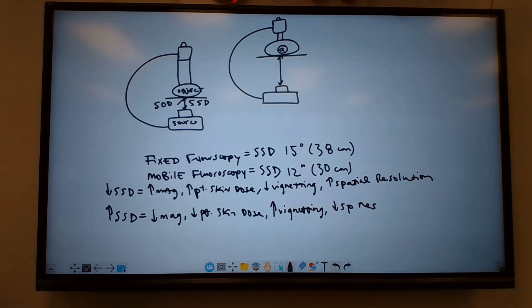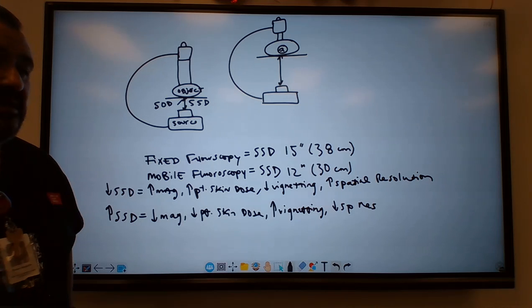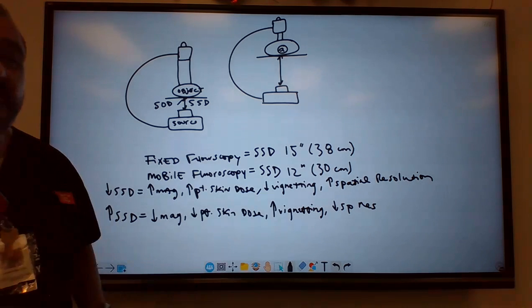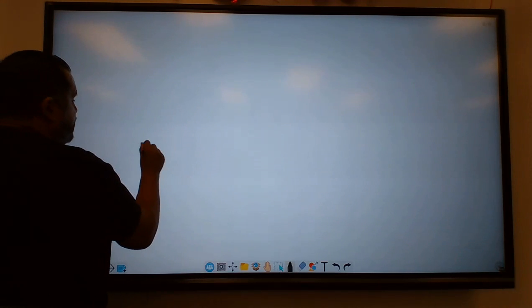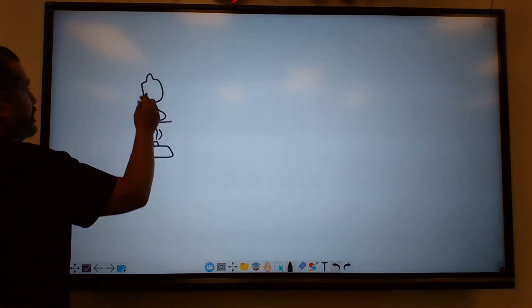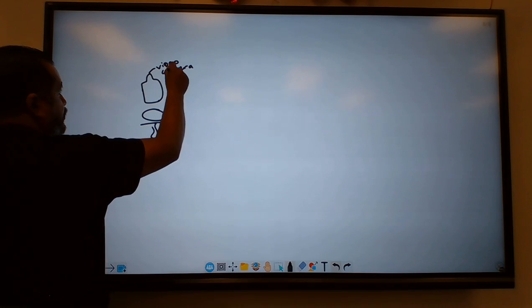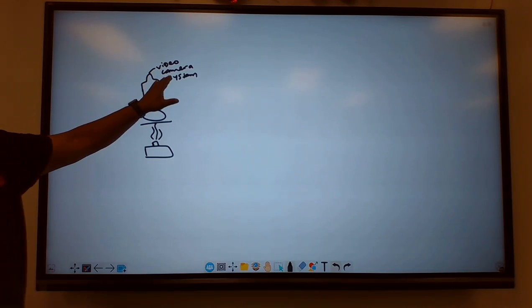All right. Now, the last thing here is the way the images are being recorded or being presented to the system to be demonstrated on the display monitor. So there's two different ways that we can have it. All right. So here's your x-ray tube. X-rays go up. They go through the patient. They're going to hit the intensifier tube, we said, correct? Then it's going to go to a video camera system. So there's something called a video camera system. This is old school, right? This is old school right here.